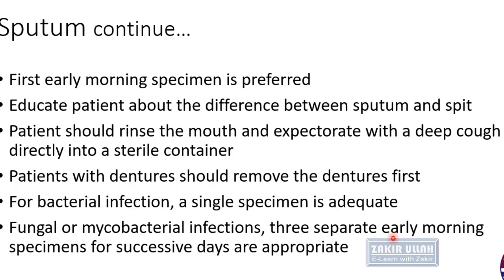For example, on the first day, we examine whether any fungal or mycobacterial pathogen is present or not. If it is present, then it is reported. If it is not present, then on the second day the sputum is examined again, and the same process is repeated for the third day.